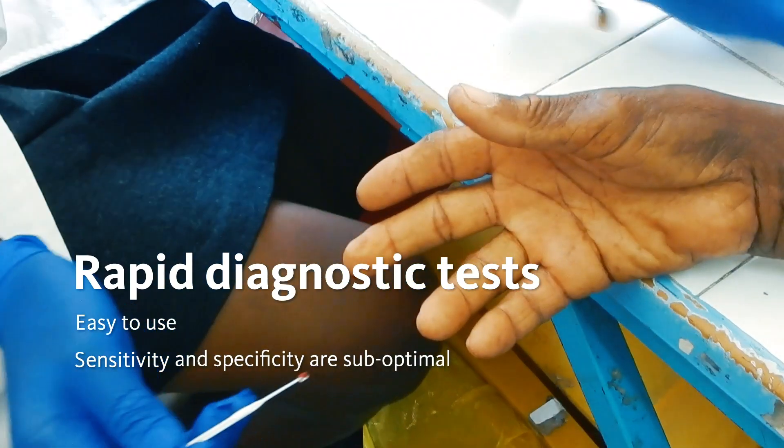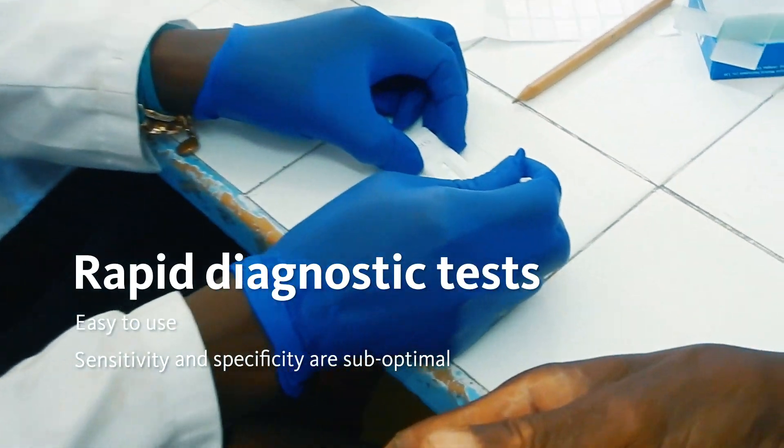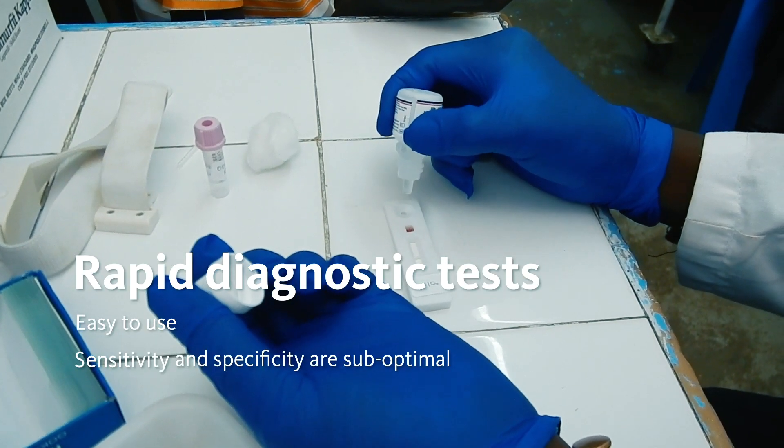Rapid diagnostic tests are easy to use, but their sensitivity and specificity are suboptimal.